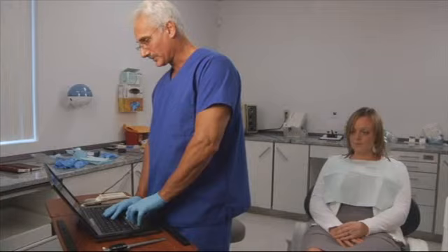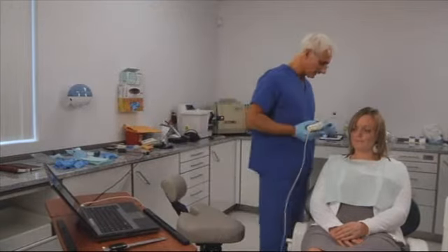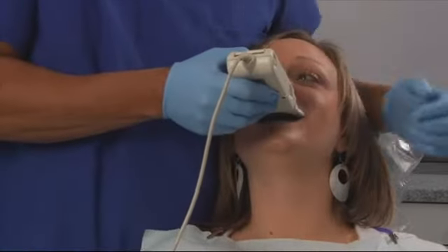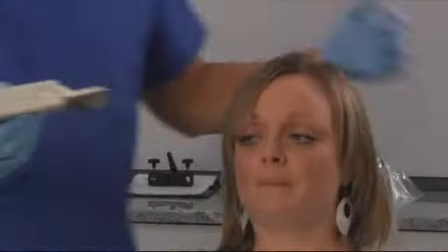And to choose a proper sensitivity, Caroline, I'm going to have you bite into the sensor, and I'm going to have you keep your teeth together when you do that. So I want you to bite down for me. Bring all your back teeth together. Try to squeeze your back teeth together. Much better. Do that again for me. Bite down again. Good, like that. And open. Bite down again. Good, and open. Raise the level a little. So we like to see 3 pink cells total to indicate the proper sensitivity.